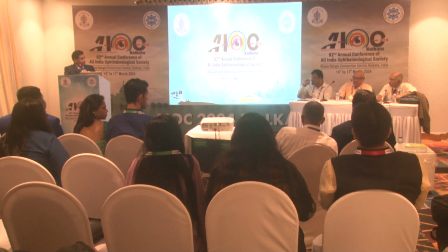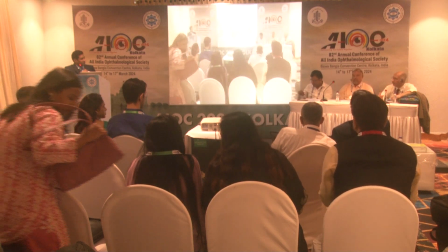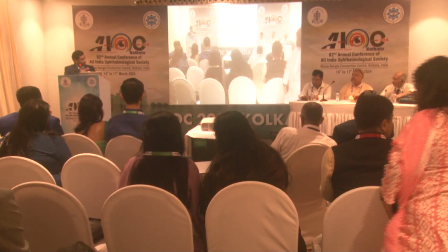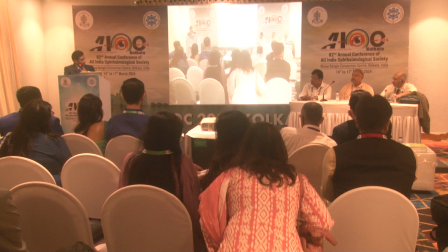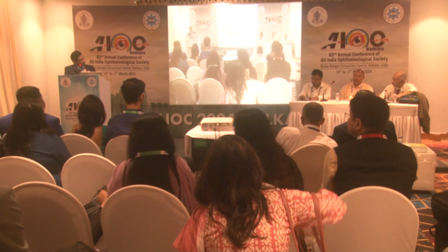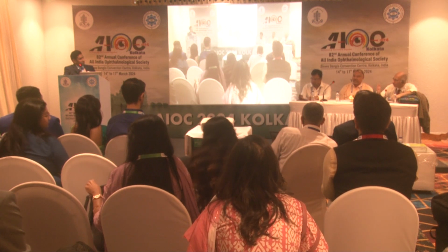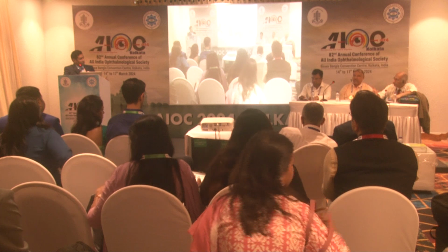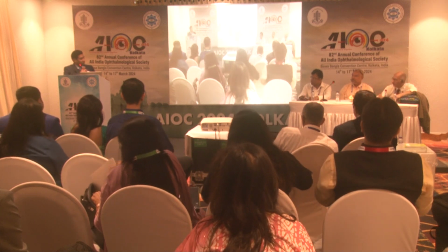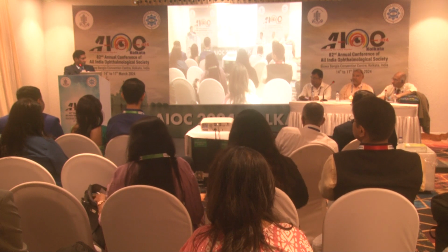Did you do a pre-operative anterior segment OCT to look at the scleral thickness? That is the best way to decide scleral thickness. Yes, we have excluded the patients with thin sclera or previous scleritis. Even in the patients who you want to inject, it would be a good idea to do a pre-operative scan at the injection site. Yes, sir. Scleral OCT can give you the exact thickness of the sclera.